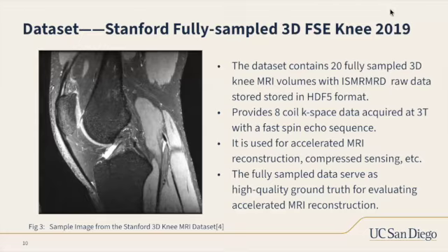Here we introduce the Stanford fully sampled 3D dataset.